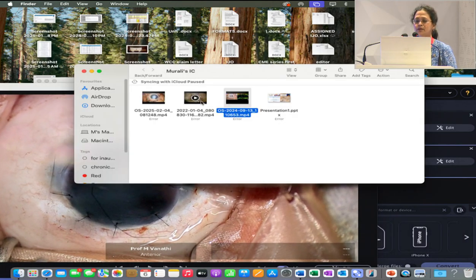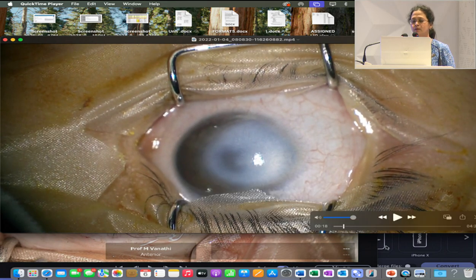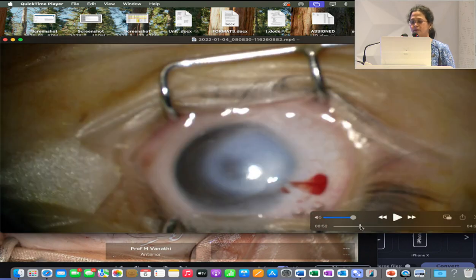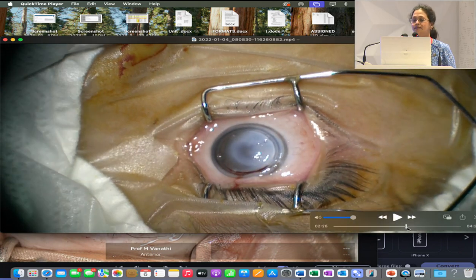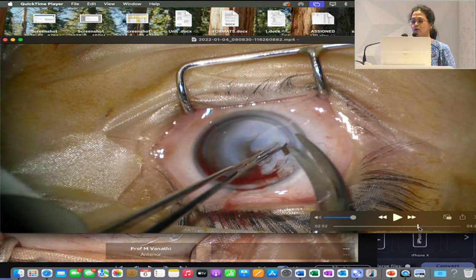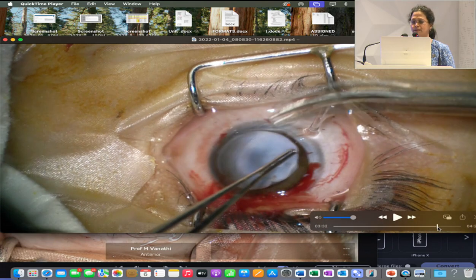So this is the third video before I finish here, and here you look at what Sushmita was showing. You have this central clearing which appears well here, and anterior segment OCT imaging helps in these particular cases when you look at how this center is behaving. I didn't have the imaging video incorporated onto this; it was separate. Again, I proceeded to do a keratoplasty for these corneas, which are particularly small, deciding on the diameters for these corneas, and deciding whether they had a pre-existing glaucoma which was missed because of the imaging difficulties, because picking up glaucoma in these patients is a concern here.